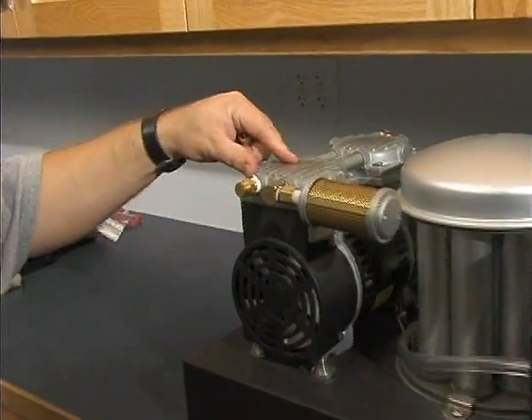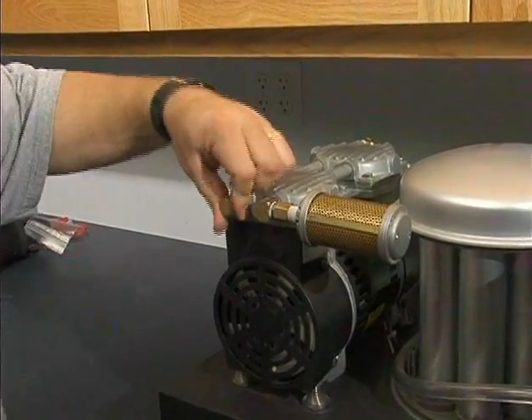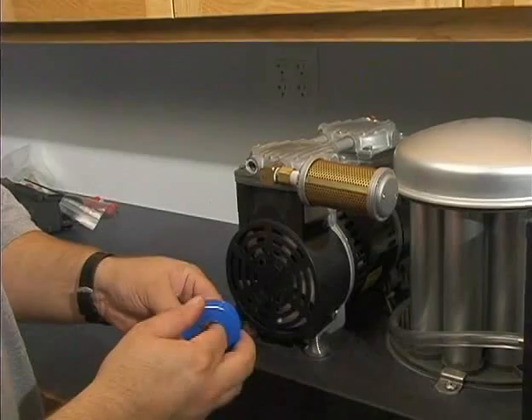The pressure relief valve is located right on the compressor. It just unscrews right off. We'll add tape to the new one and put it on.